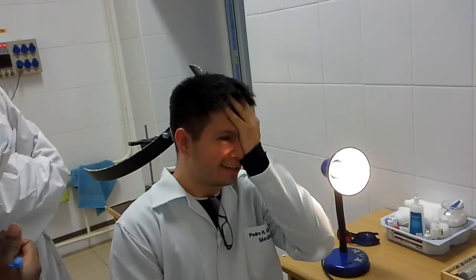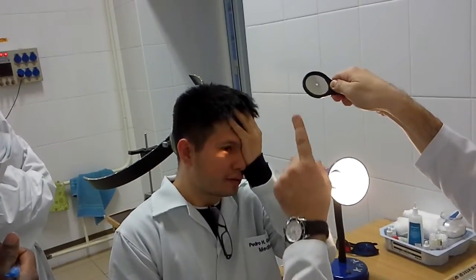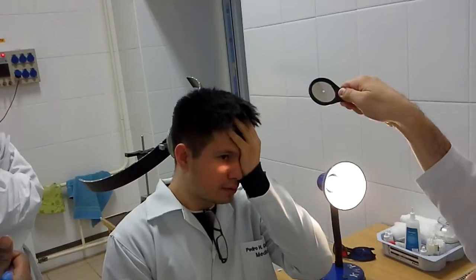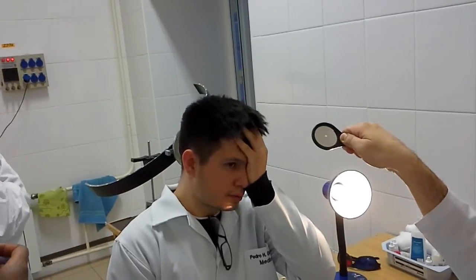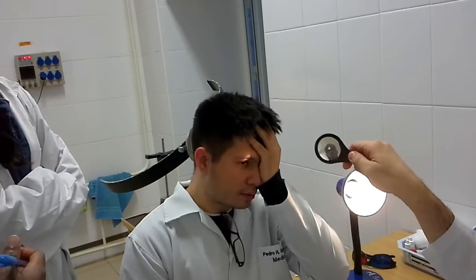Okay, so where is the light now? Okay, now. Up. Don't forget the one mistake during the credit: if the light is somewhere but not on the area of the pupil, of course, in this case a patient with really poor vision can't recognize it. Your partner, of course, will see your hand, the ophthalmoscope, and the answer will be true, but we will see that if the light is here, of course it's a wrong manipulation.